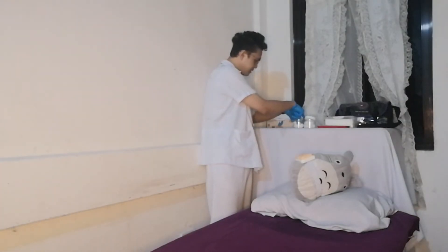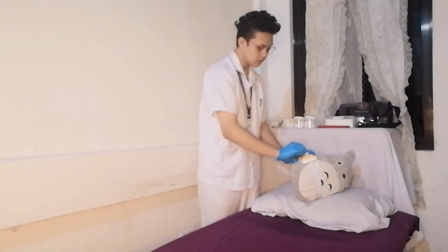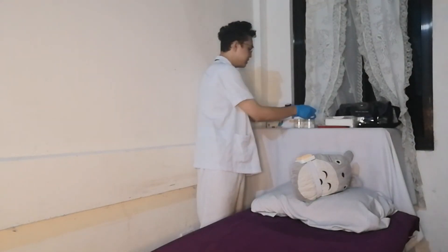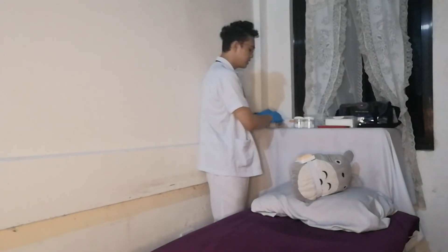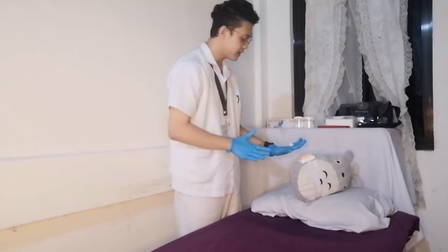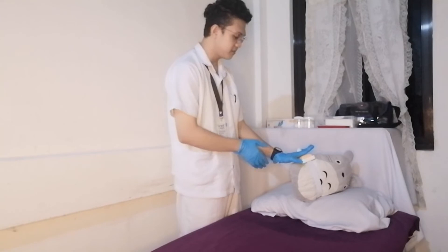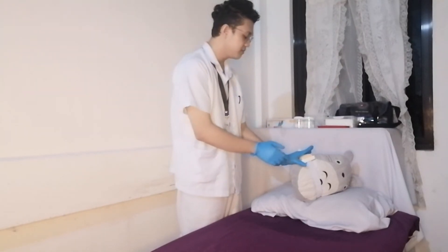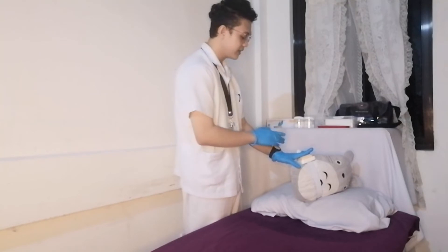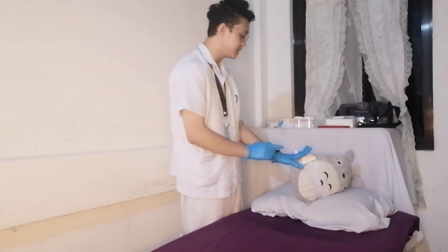I'll be disinfecting the site with an alcohol swab in an outward circular motion. I'll be preparing a dry cotton ball between my third and fourth finger for applying pressure later. To locate the injection site at your ventral gluteal area, I'll be placing the heel of my hand over the greater trochanter, perpendicular to the femur, pointing my thumb towards your groin, my index finger towards your anterior superior iliac spine, and my middle finger along the iliac crest towards the body. My middle finger and index finger form a triangle, and the center of the triangle will be the injection site.